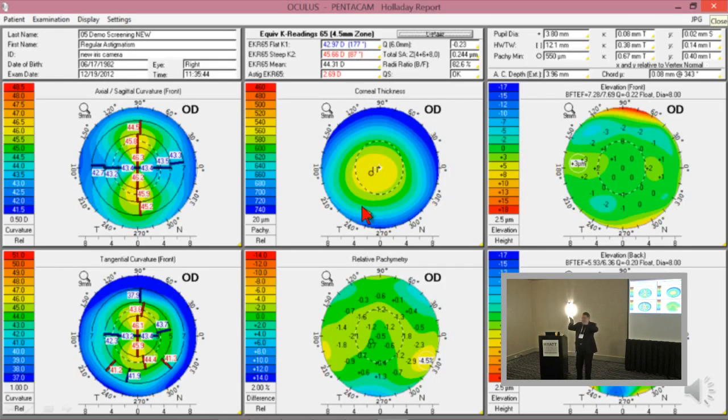In other words, what happens is we get a trough in a myope, we get a peak in a hyperope, so that central power is a little bit stronger. So you'll have a tendency to have a hyperopic surprise, all right, in somebody because the center of that cornea in a myope is actually a little flatter than you thought, okay? And it's just the opposite in a hyperope.